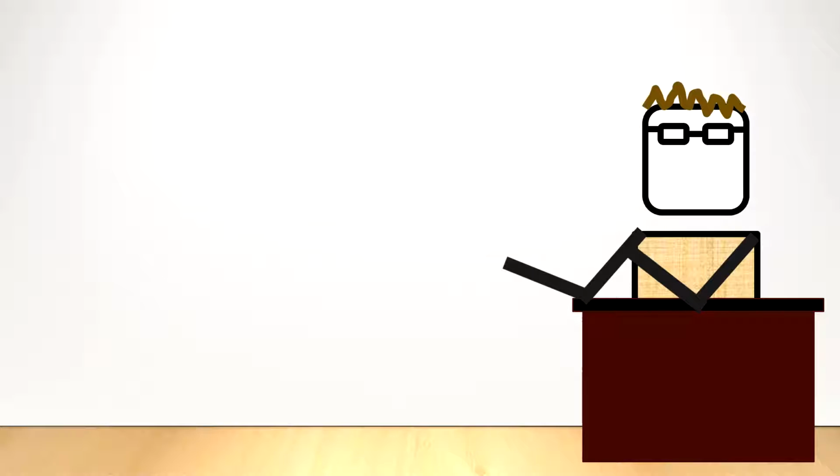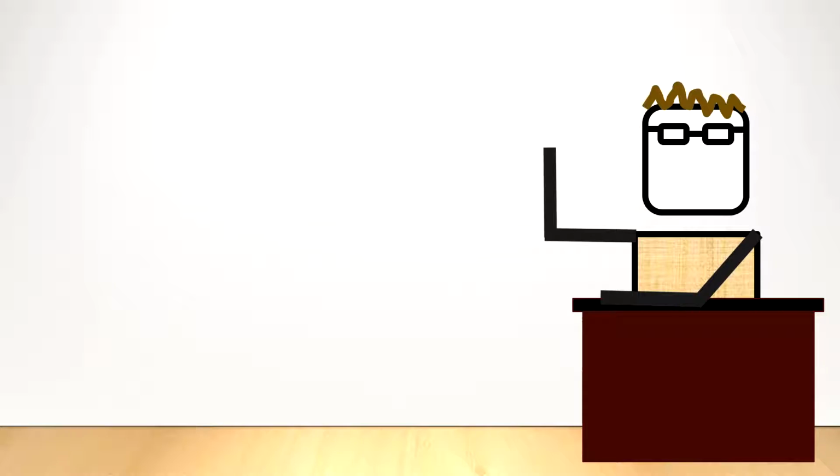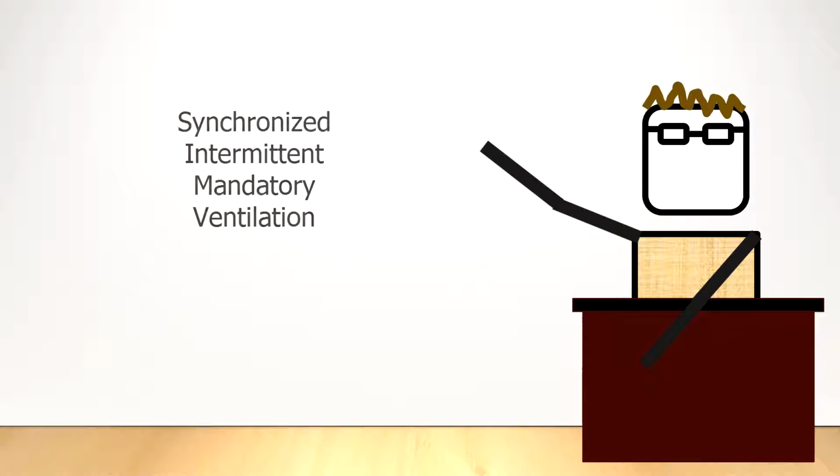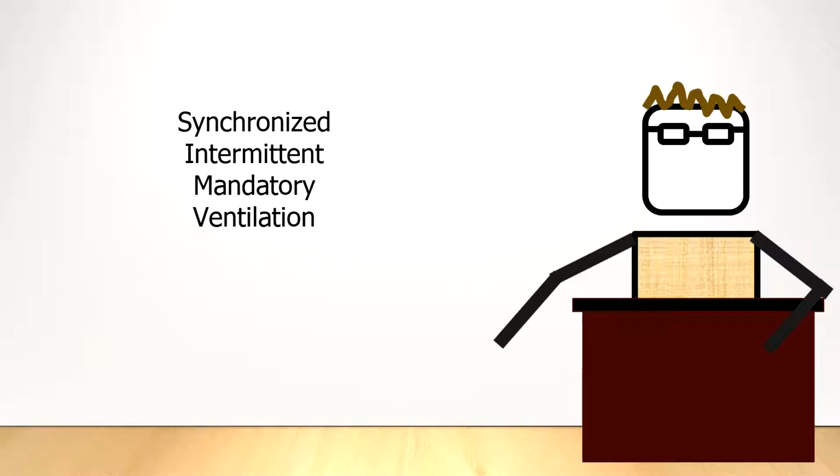In addition to the other modes of ventilation that we've discussed, there are two modes that don't quite fit into those molds. The first is SIMV, also known as Synchronized Intermittent Mandatory Ventilation. This is essentially a volume control mode with a different breath sequence.